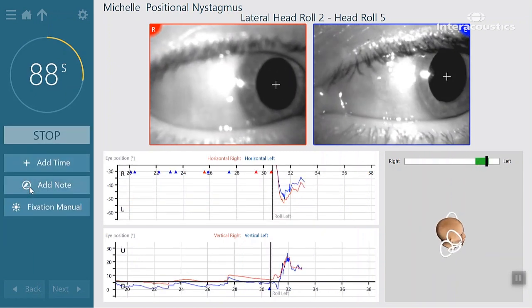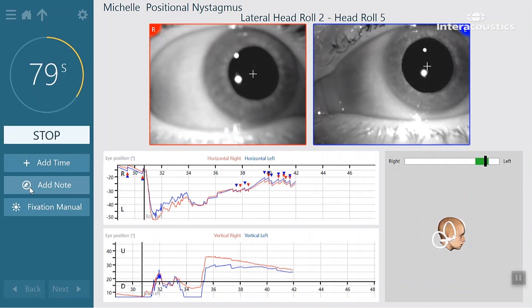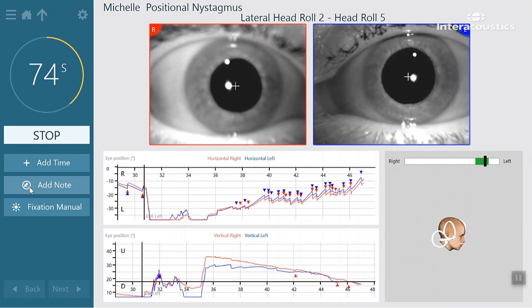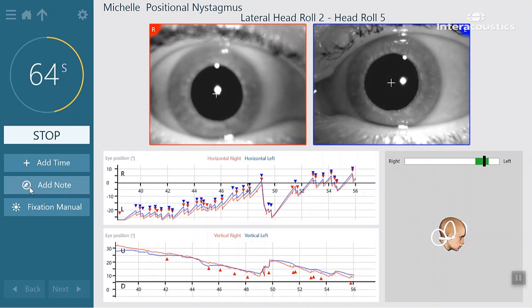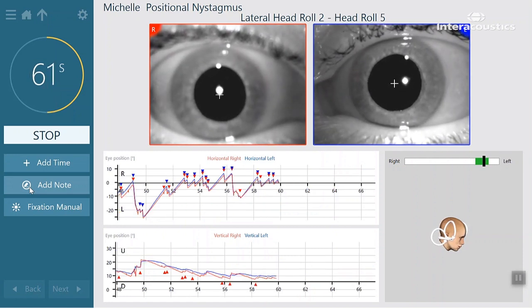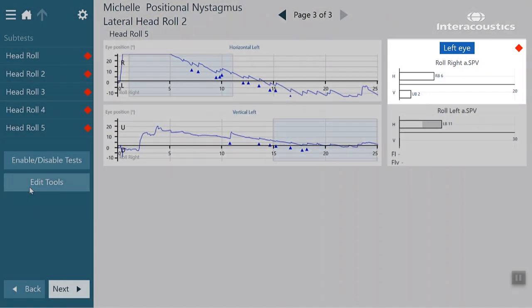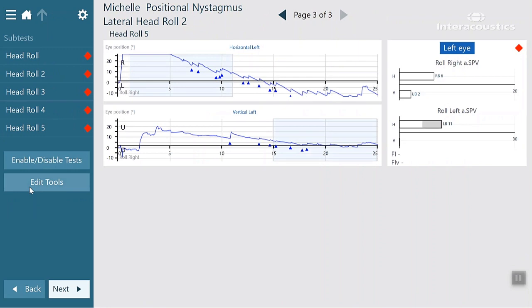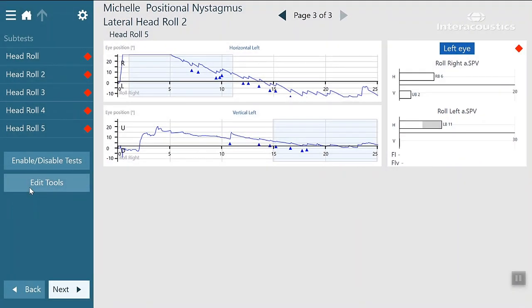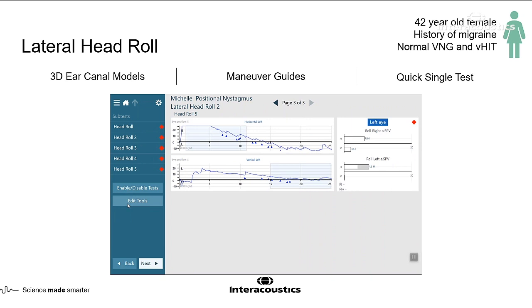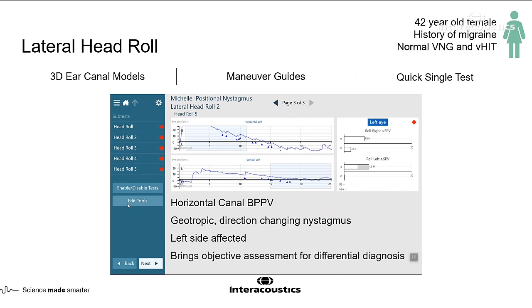Now we see the nystagmus starting to beat to the left. When the patient has their head to the right, they have right-beating nystagmus; when they have their head to the left, they have left-beating nystagmus. This is geotropic nystagmus, which tells me that those crystals are in the horizontal canal. When the test stops, a bar graph pops up for a quick glance at which side is affected. The right side shows right-beating nystagmus of 6 — 6 is the cutoff for normal, so that bar is white. When they turn to the left, we see 11 degrees of nystagmus, shown in gray because it's higher than 6. So with one quick glance, we know the left lateral canal is the affected canal.